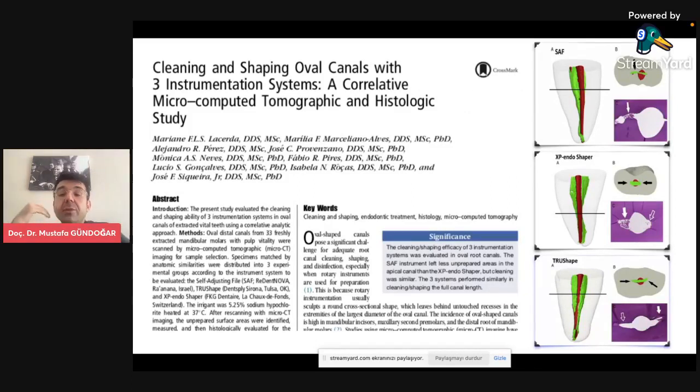They used the manual methods by needle irrigation and just using late advancements in root canal shaping, and without activation of root canal irrigants, there are always untouched areas if you only use your mechanical instrumentation technique. Your sodium hypochlorite should penetrate into these untouched areas. You cannot achieve this by only using needle irrigation.